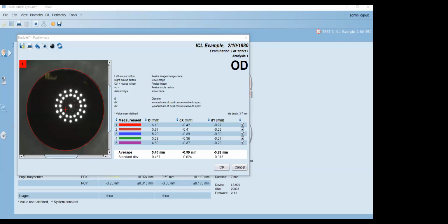I just want to caution you, if you ever measure that ICL patient, you may want to look at the A-scan just to confirm you're not accidentally picking up on that implant lens and falsely making your lens thickness too thick and your ACD too shallow. Now, on that patient that I showed you, I ran calculations before and after, and it really only just shifted the intended refraction. And depending on how much those gates move, if they're moved more, then it's going to affect the calculation more.